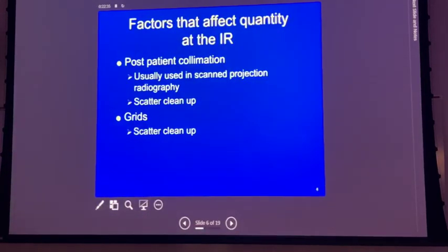I've never worked with a unit that is a scan projection. I've worked with dedicated chest units, never seen a scan projection unit. You do see them in CT though. That's how CT really works, kind of like a grid. Then grids, scatter cleanup, we already talked about grids.